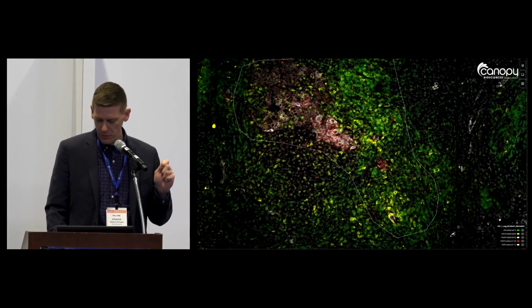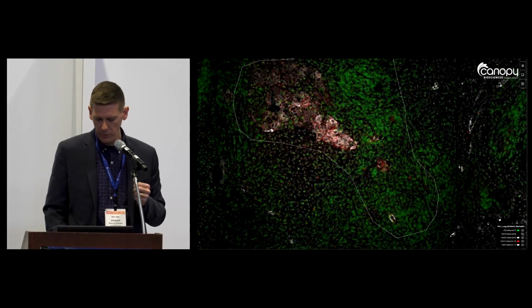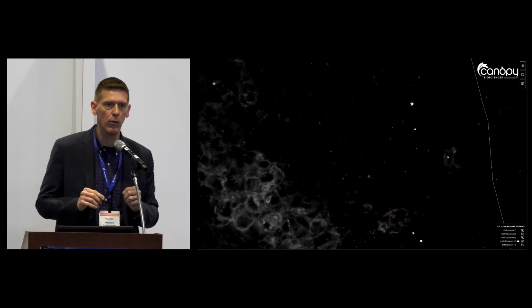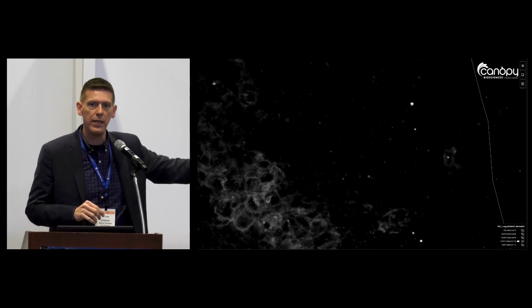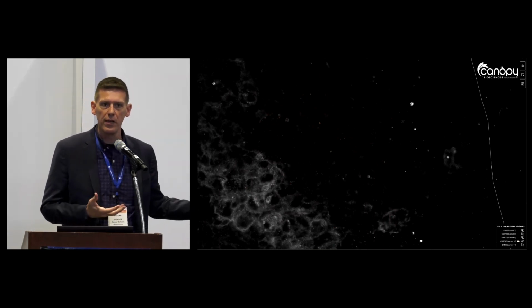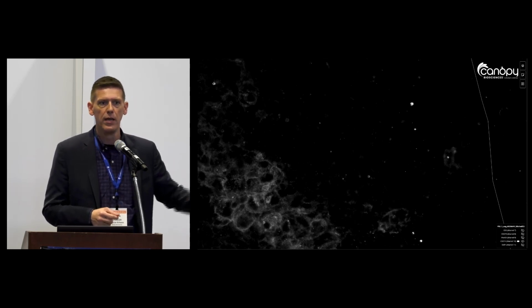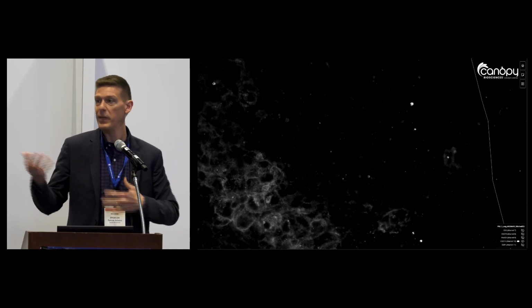But considering HDR particularly, if we peel away some markers, so maybe we'll peel away PD1, we'll peel away these canonical markers and just take a look at PDL1. So we have, of course, massive expression of PDL1 that you see on these tumor cells, but you also see expression on those immune cells. Immune cells too also produce PDL1, so it keeps them from eating each other.